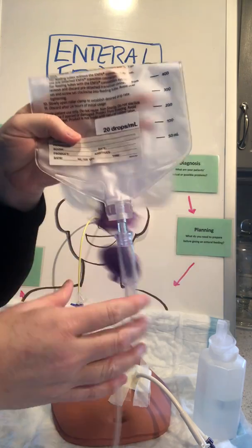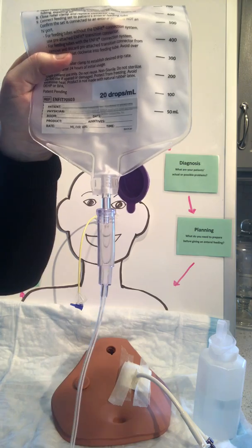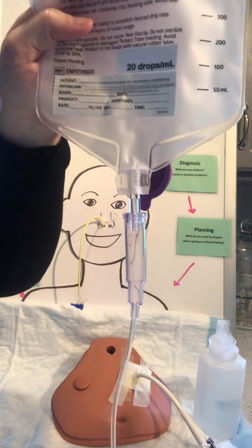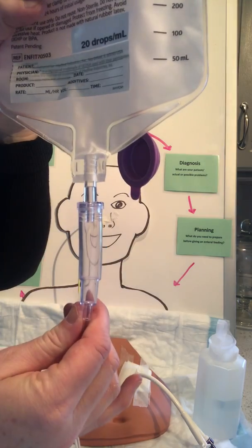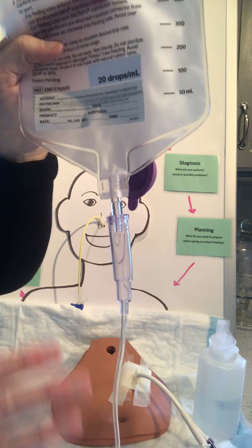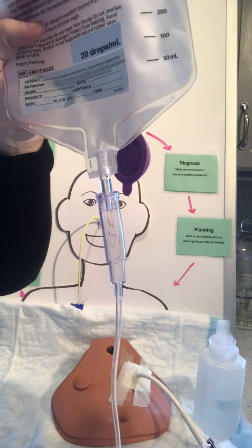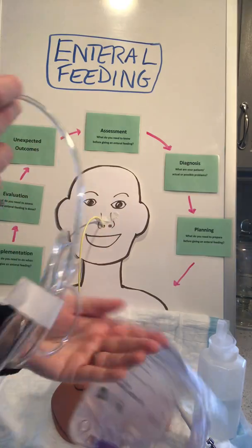Right below the bag is what's called a drip chamber. And so whenever we do any type of gravity infusion, we have to actually be able to see the drips. We're going to learn about this again week 13. We're going to be talking about IV infusions using the drip chamber instead of using a pump that controls how fast it goes. We use counting the drops that are falling as determining how fast it's going to go in the patient. And how we control how fast it goes in is on the tubing itself.